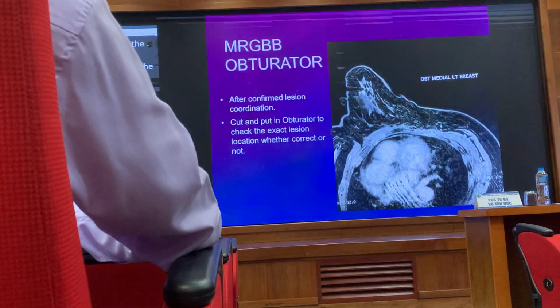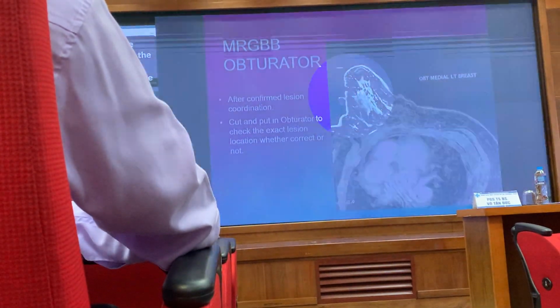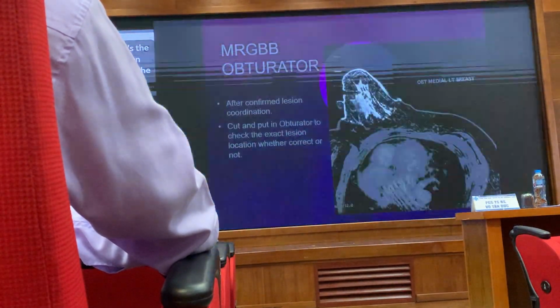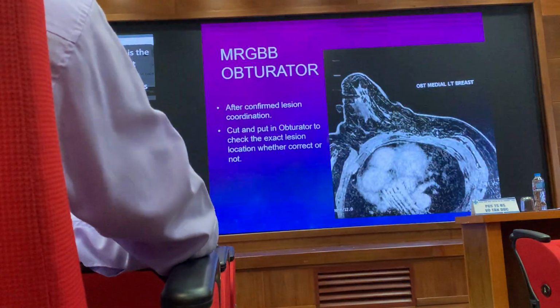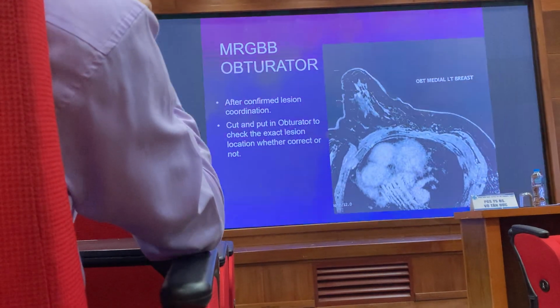Okay. So this is the one. We put in the obturator, we reach the lesion that we want. So we confirm, this is the accurate one. This is what we want, confirmed already. Then the next step, the radiologist will directly do the biopsy on the region.